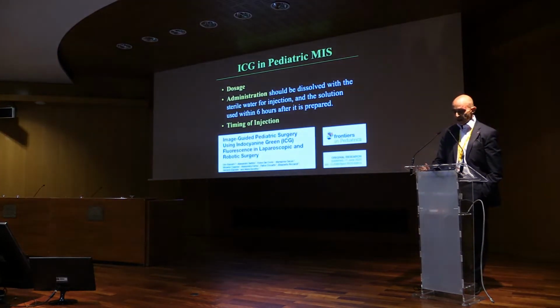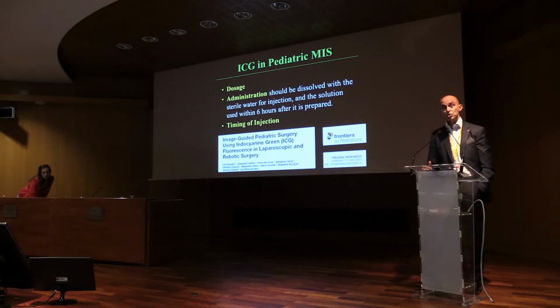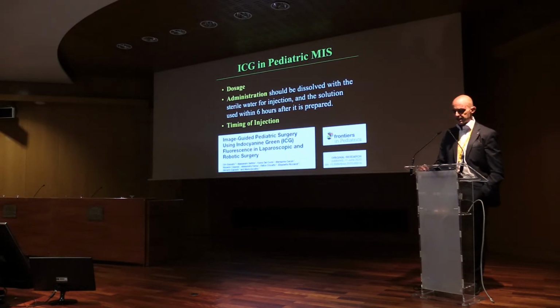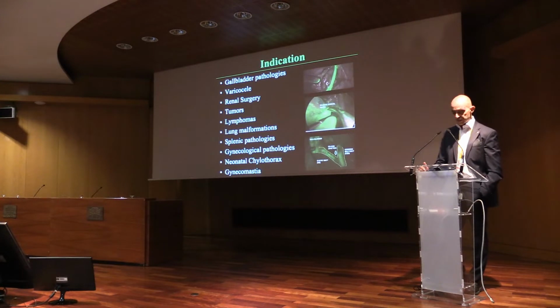The timing of injection is important because it can vary according to the pathology. In general, for the gallbladder you have to inject the day before. For the other indications you have to inject intraoperatively, intravenously or directly into the organ, as you can see in the slides.